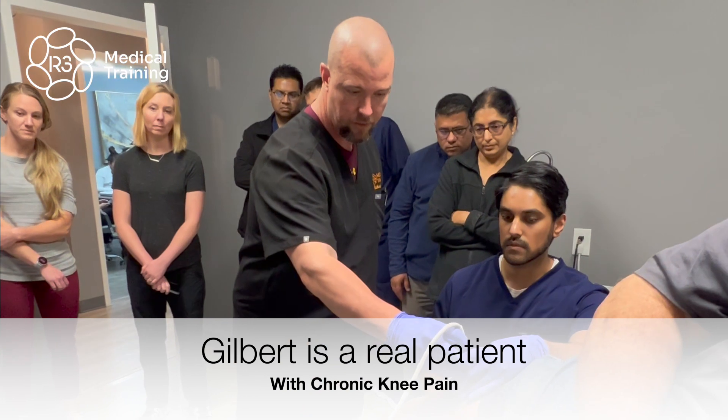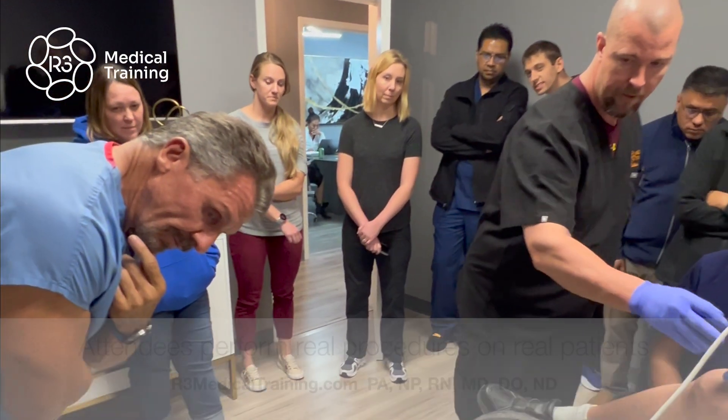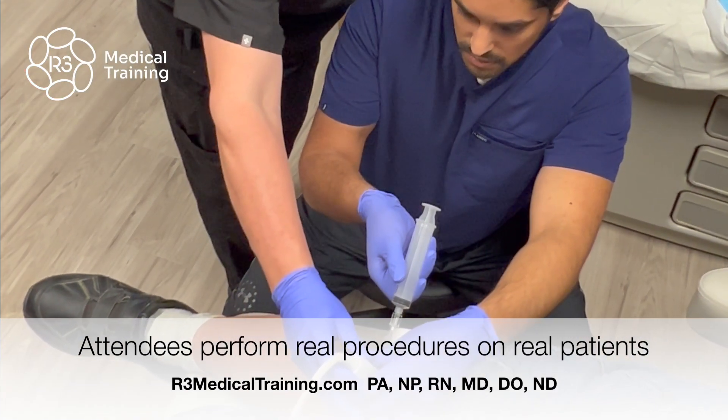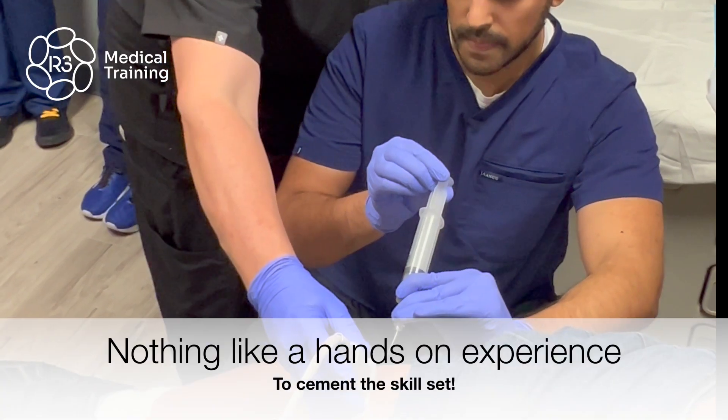Lighten up all your pressure just a little bit. Everybody see that space that we're talking about? We're going to have a lot of space. Advance just a little further. I see the needle — nice and sweet. Go ahead and aspirate out, go about 10 cc's out.